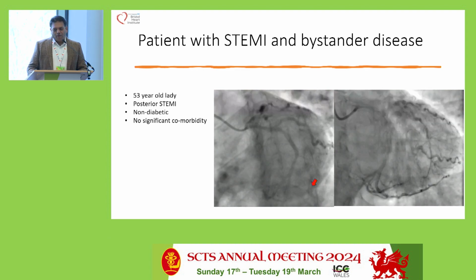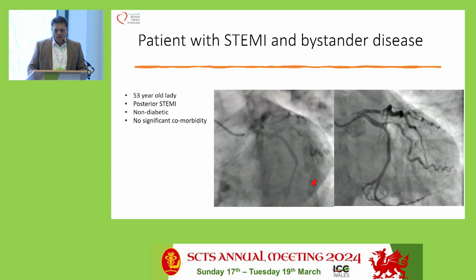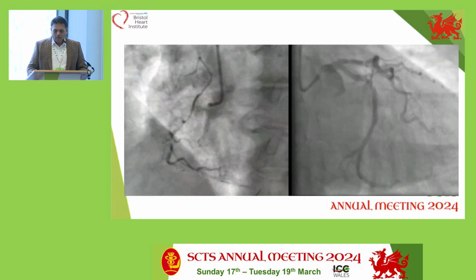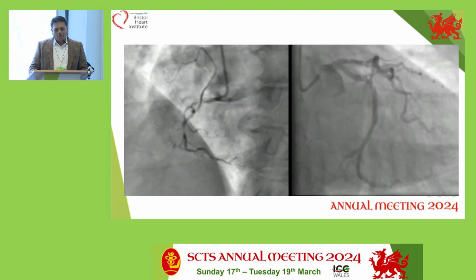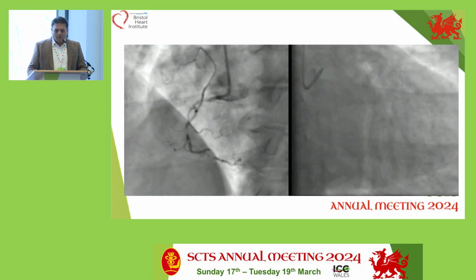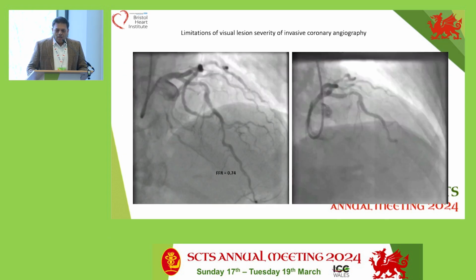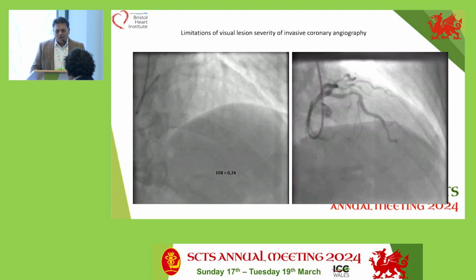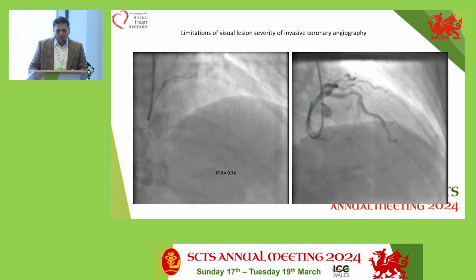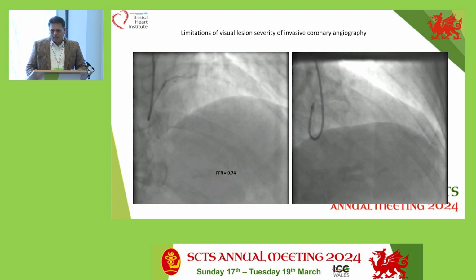She has non-culprit lesions. Specifically, she has disease in the OM1, which looks moderate to severe angiographically. And she has a codominant system, but the right coronary artery is recessive in a general sense. She has come back to the lab for the assessment of the other lesions. When we assess the LAD, you see that there are sequential lesions in the mid-LAD and then distal LAD. And angiographically, it appears that the distal LAD lesion is significant.